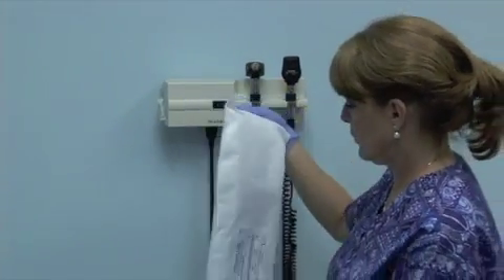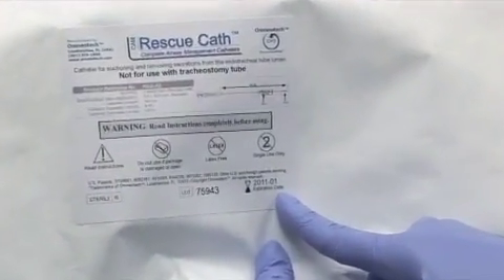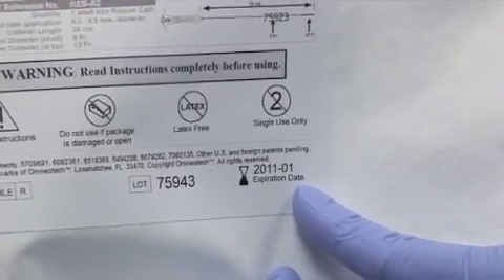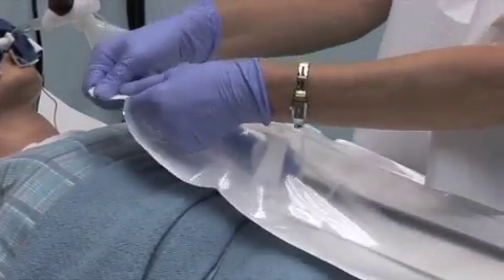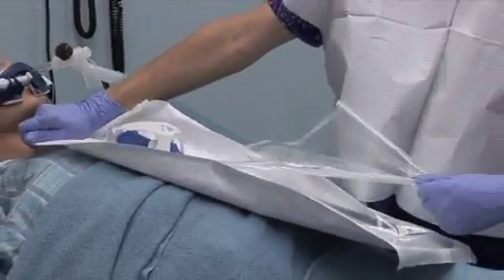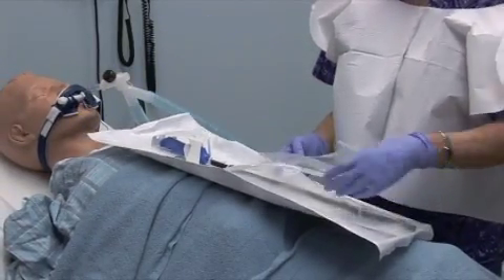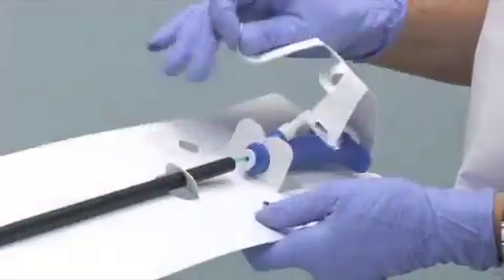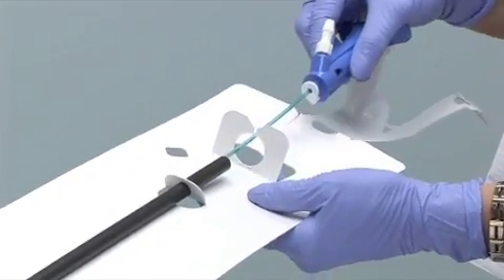Ensure that the Rescue Cath and its package are not damaged. Check the expiration date on the package label to ensure the sterilization shelf life has not expired. Open the package at the chevron flap, maintaining the sterility of the catheter from the depth calibrator disc distally. Put on your eye shield and mask, and don your gloves. Remove the Rescue Cath from its package, noting that the protective black packaging tube is not a part of the Rescue Cath.